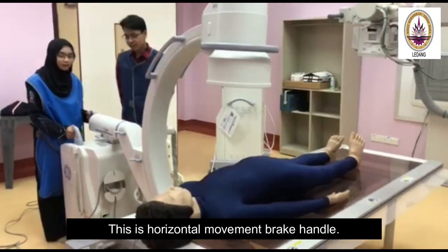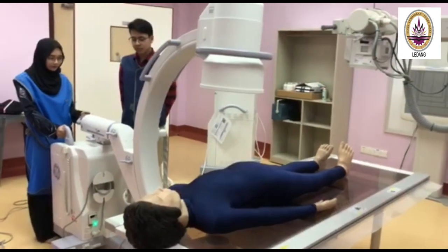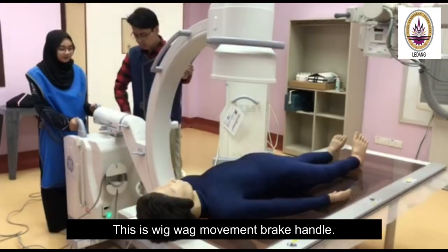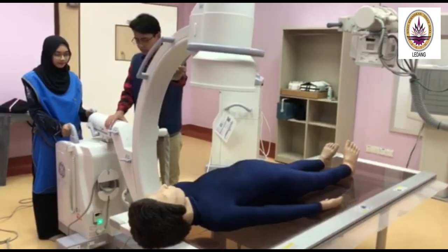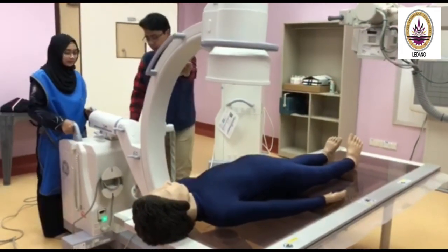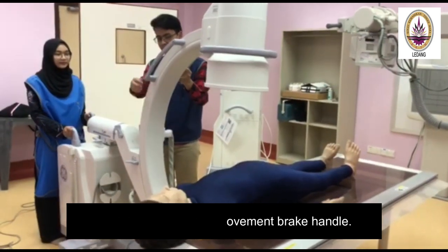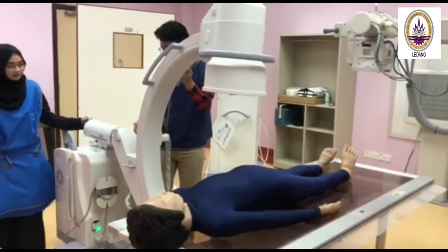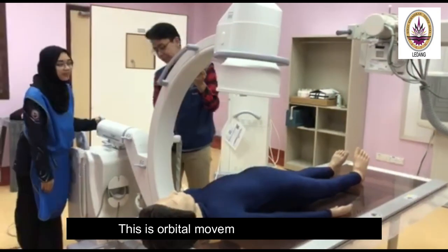This is the horizontal movement brake handle. This is the wig-wag movement brake handle. This is the lateral rotation movement brake handle. This is the orbital movement brake handle.